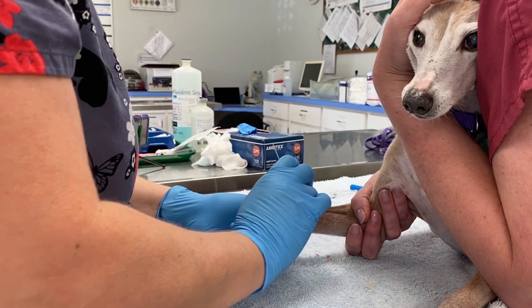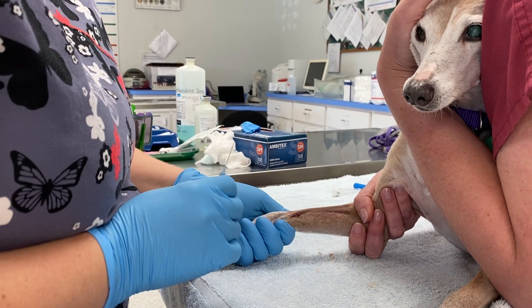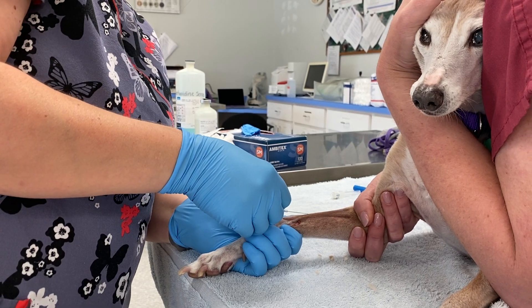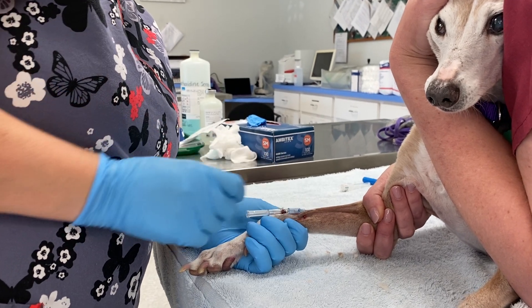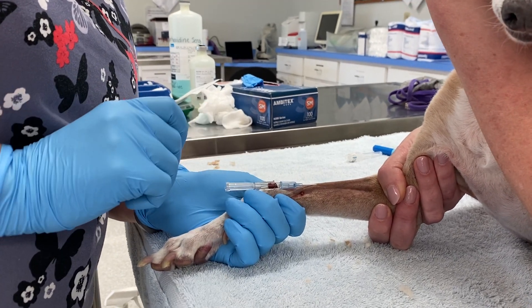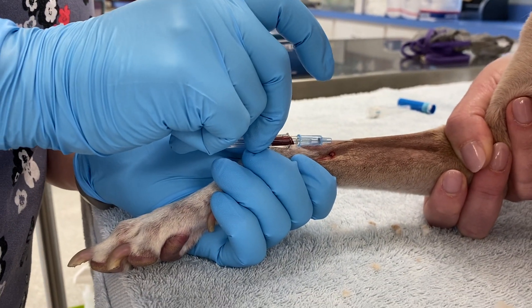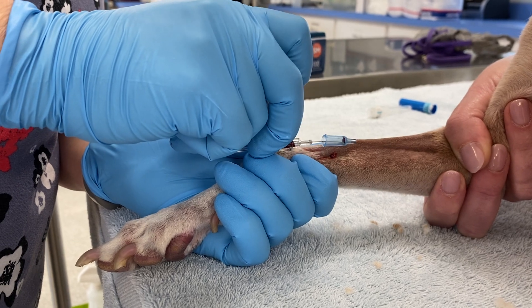The vein runs along the top and it branches off to the side into an accessory vein. I'm just going to go for the top. Put it at a slight 45-degree angle, your bevel up. Slide the catheter in until you see the blood flush backwards. You're going to want to hang onto the needle with your fingers, and then use your pointer to slide that forward.